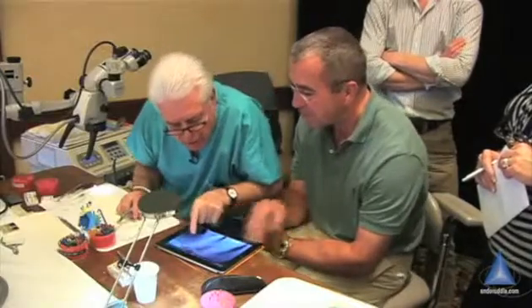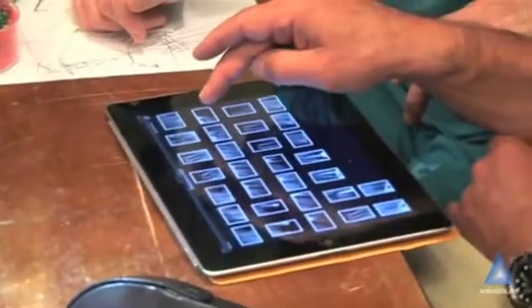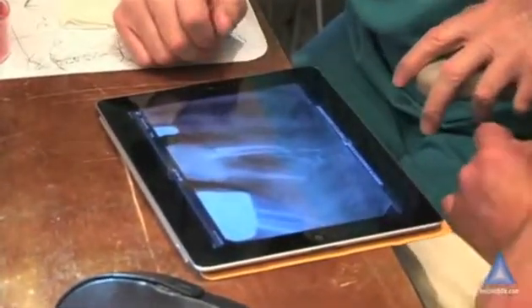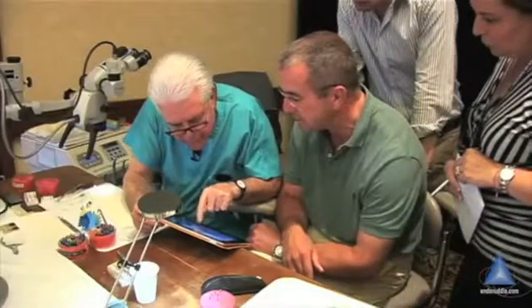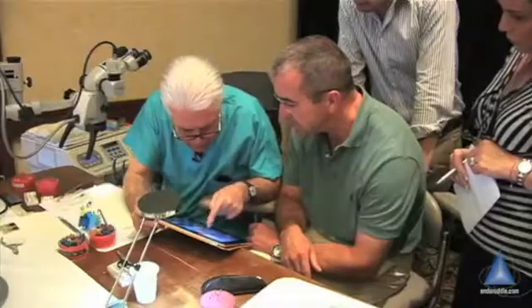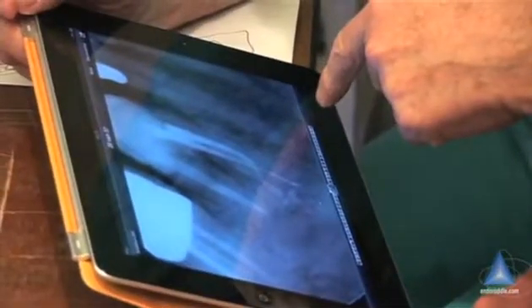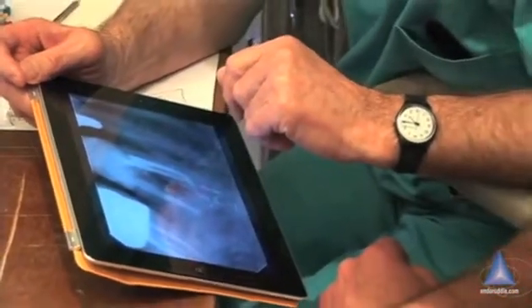But you have wonderful shapes. You must be thrilled! I want to see that one — oh my goodness. And you got a furcal canal. You went around a nice curve coming down here. This is good. This will be interesting to see if you get bone fill.